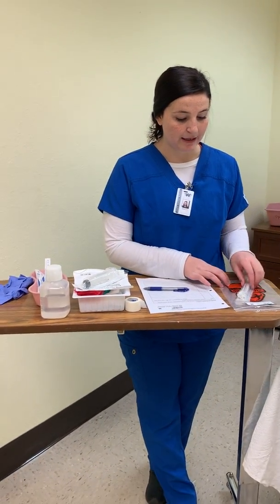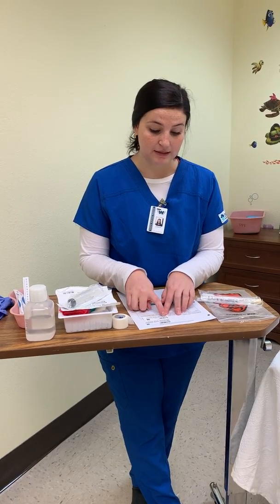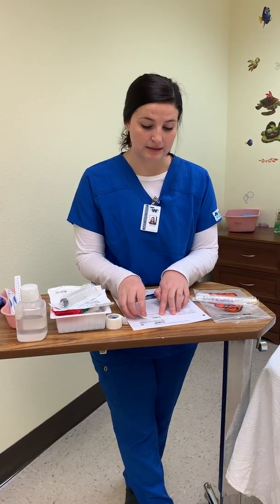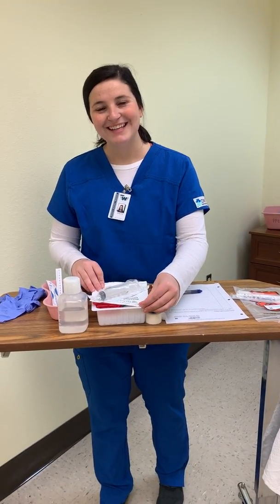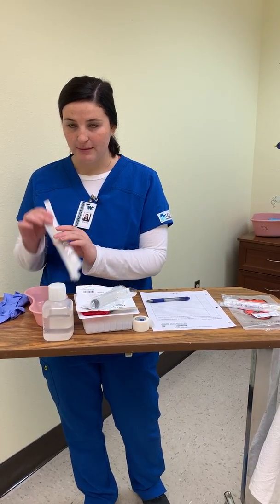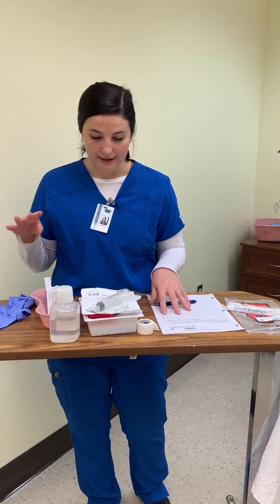I'm just going to make sure before I go into my client's room that I have all of my supplies. It looks like I have my biohazard bag and my culture swab. I also have a label for this that I'm just going to cross-check to my client before I go in there. It is for Shirley Coast, 5/14/1964, so that matches as well. I have a not opened, sterile dressing change tray. I have a syringe, and I have everything to measure. I also have normal saline, fresh gloves, and a kidney basin as well. So I'm going to go ahead and go into my client's room now.